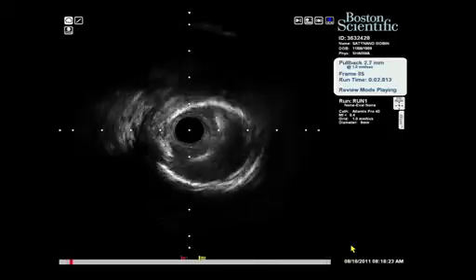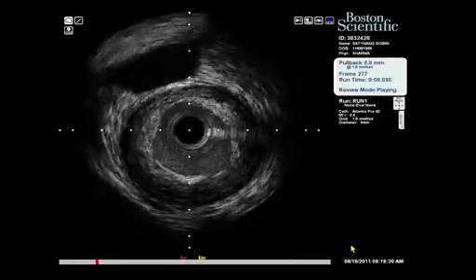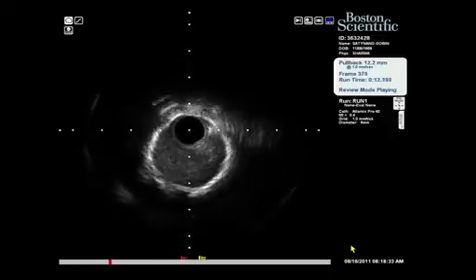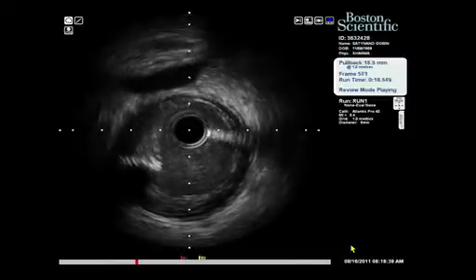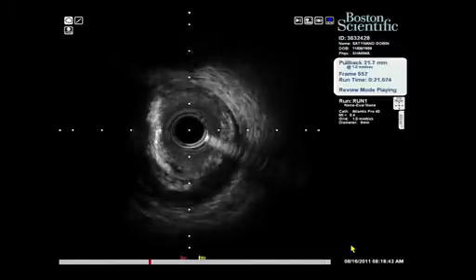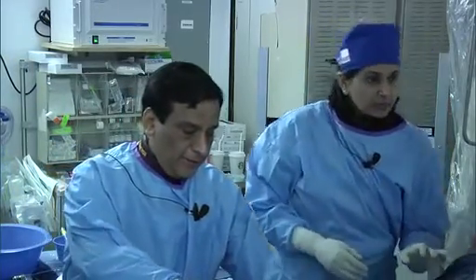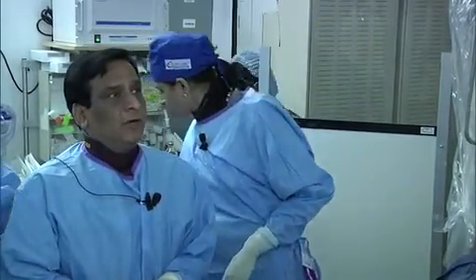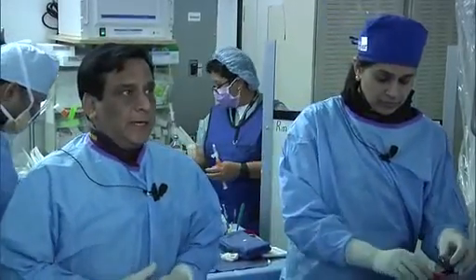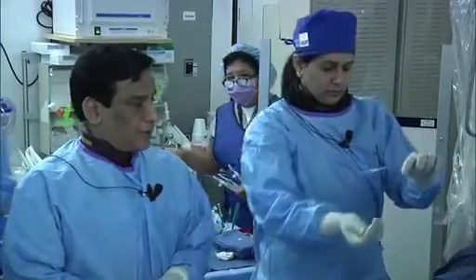The distal stents, we do not have exact information on what those stents are. We know that the left sided one was a Taxus stent which re-stenosed, and look at the very great arc of calcium, calcium at the level just before the lesion starts. So Sameen, in one single case you are summarizing the results of the COMPARE trial. Yes, incredible. Absolutely, the question has basically come up that the paclitaxel coated stent definitely had higher restenosis, as we know, particularly in the more complex cases, compared to the everolimus. And here is a nice example of the sirolimus eluting stent.